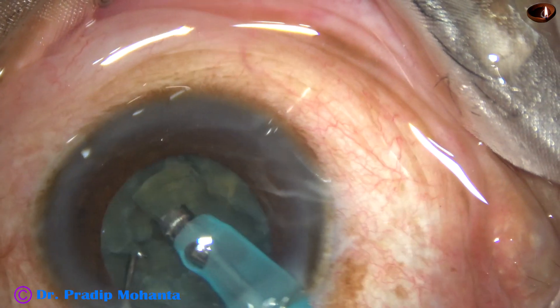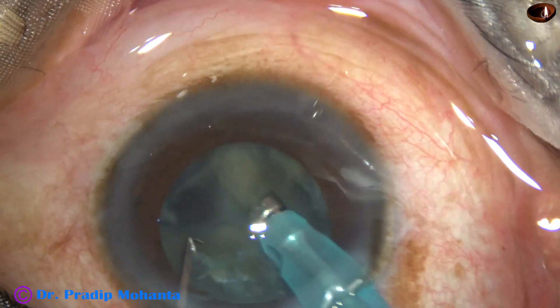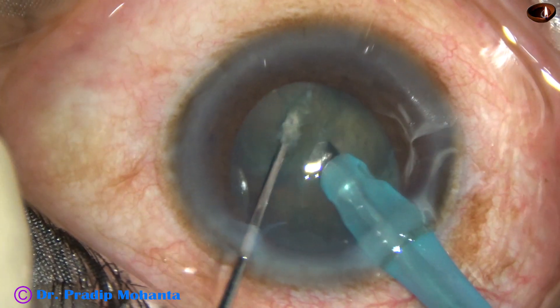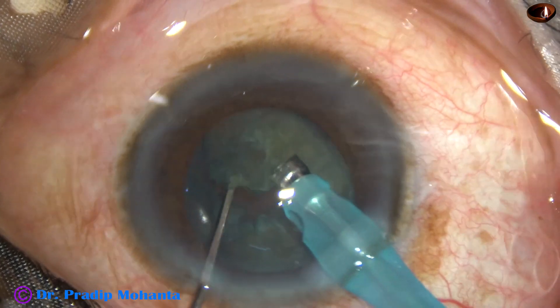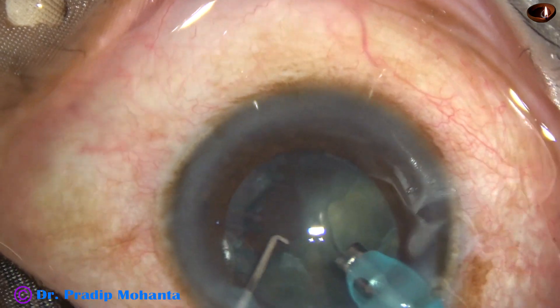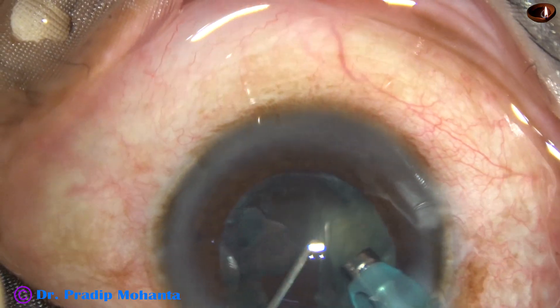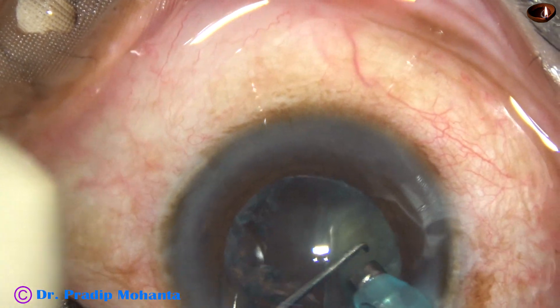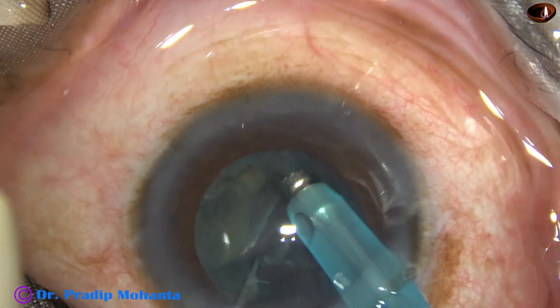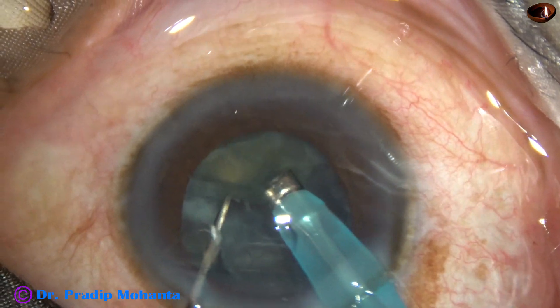No vacuum is used — that's why it is known as mechanical chop. This term mechanical chop has been coined by Dr. Sri Ganesh of Nethradhama Superspeciality Eye Hospital at Bangalore. This is a very nice term because we are not using any vacuum; we are dividing the nucleus mechanically by two instruments.